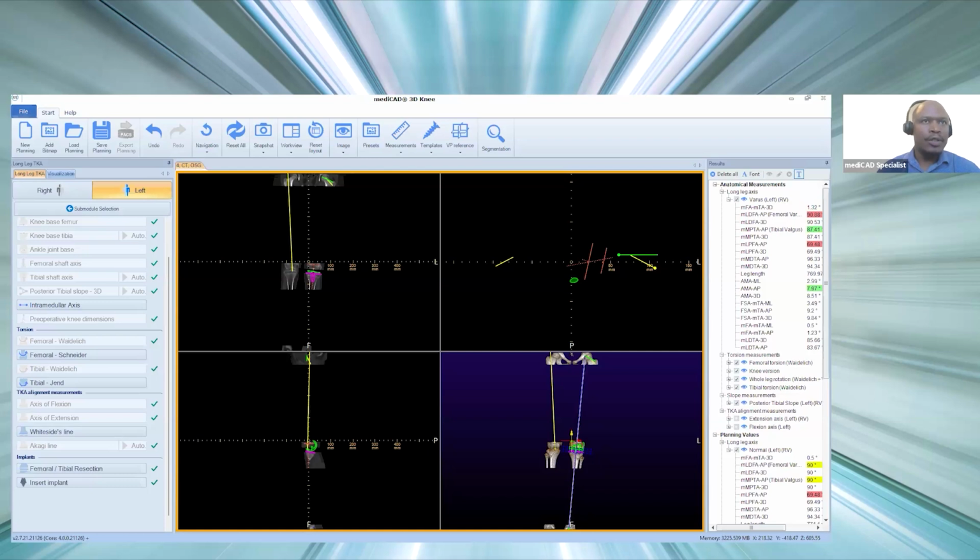Right. And I know a lot of surgeons say the number one thing is legal. And the second thing is they want to make more money. And the third thing is they want to save time and be more efficient. So this software helps prevent a lot of legal issues, and helps you save a lot of time, which means you can do more planning and more surgery, which in turn means you make more money. Also enhanced preoperative simulation and 3D printing support, right?